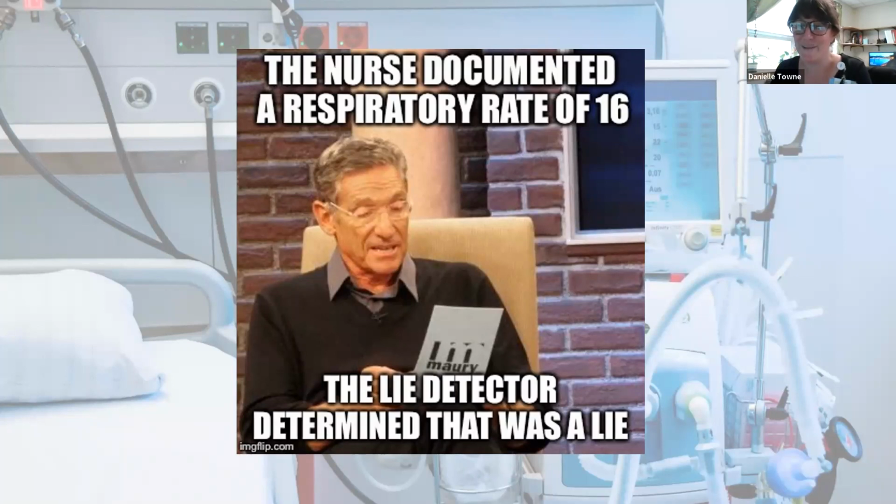So it's very easy to get into the wormhole of, oh, my end tidal is too low, and so I think I'm going to need to turn my respiratory rate down, right? Because if my end tidal is low, I'm breathing off too much CO2. So that means that I want to slow my respiratory rate down to hold on to a little bit more CO2 so I'm not blowing so much off. Well, if your patient's spontaneously breathing over the vent, it doesn't matter what you turn that number to on the vent, they're overbreathing. So the only thing that you can do in that situation is sedate them more to get that respiratory rate to actually fall in line with what the vent's trying to do. So lots of factors go into this that can make it pretty complicated.